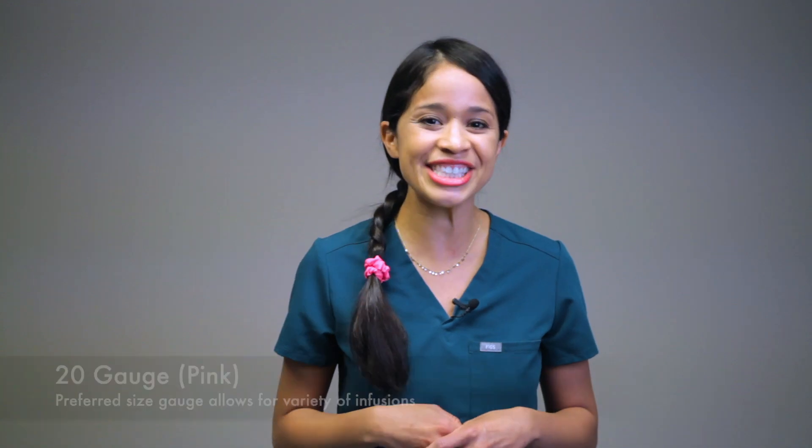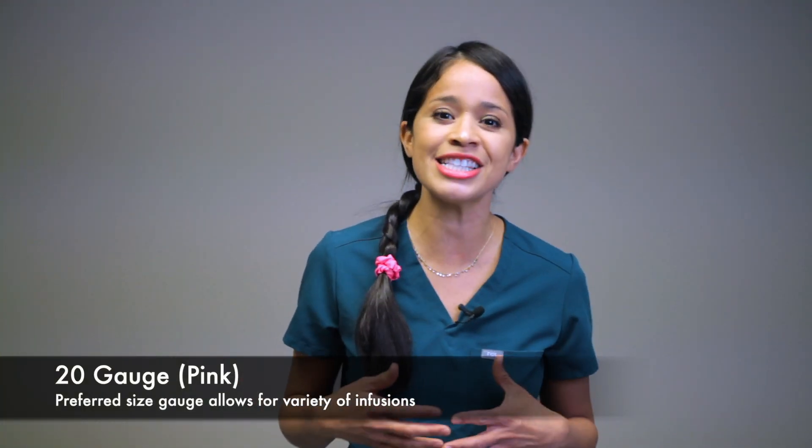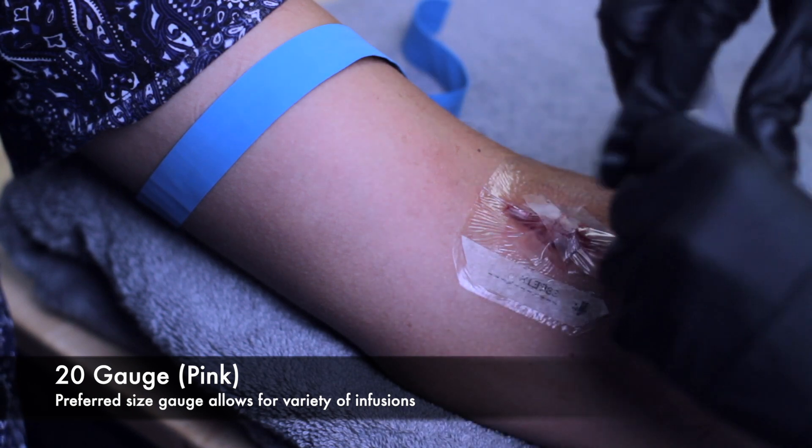The 22 gauge line can administer antibiotics as ordered and is used temporarily as a saline lock. Sometimes it will be a TKO peripheral IV — meaning to keep vein open — so normal saline will be infused at about 10 mL per hour to keep the line patent. Next is your 20 gauge, which is pink — your pink flowers. This is the most adequate for blood transfusions, IV fluid boluses, IV maintenance fluids, antibiotics, and electrolyte replacements. This IV is your ideal gauge because it gives you more options to infuse at a faster rate if needed — it's always the preferred size gauge across the board.